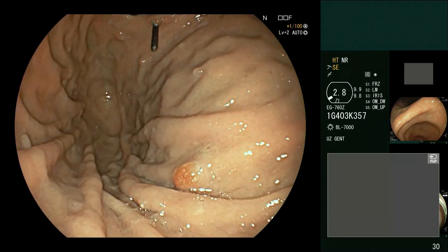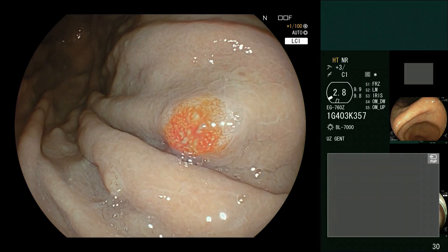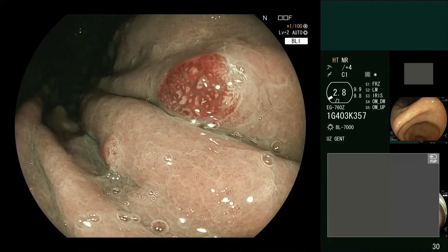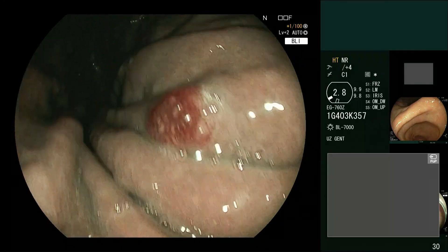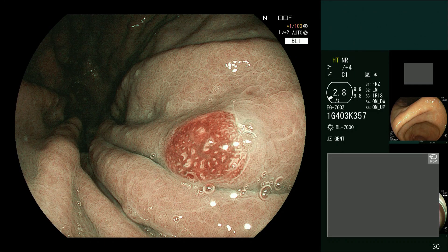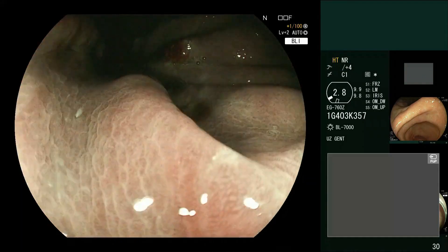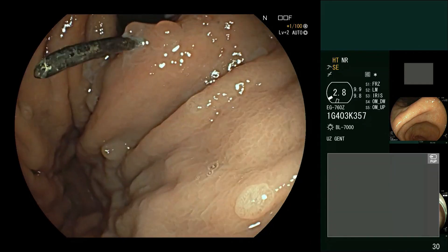Now we have a much better view and you can clearly see that clip. Let's start talking about polyps. Here in white light, in LCI, and in BLI narrow band — or iScan, being the other modes of virtual chromo endoscopy. Here you have a clearly hyperplastic polyp. Why is it hyperplastic? It's completely regular, entirely circumscribed, quite small, the structure is regular, and it's quite hypervascular. You see therefore this very brown appearance against the background in BLI and very red against the background in white light. This is a hyperplastic polyp.